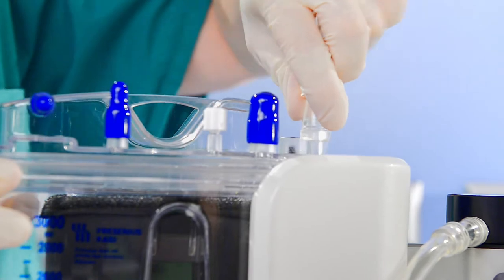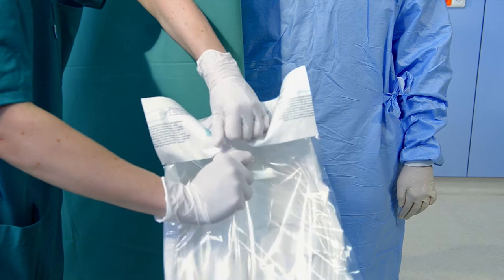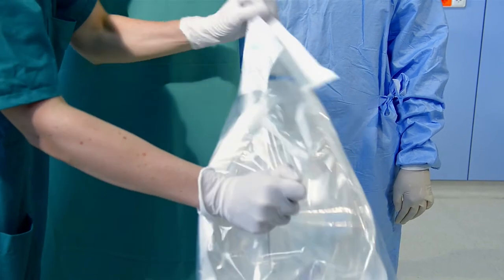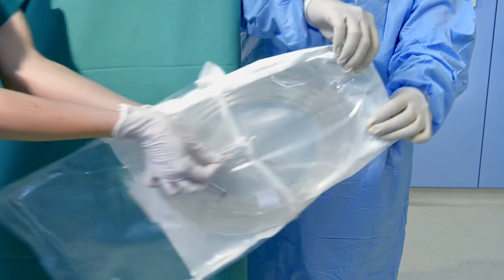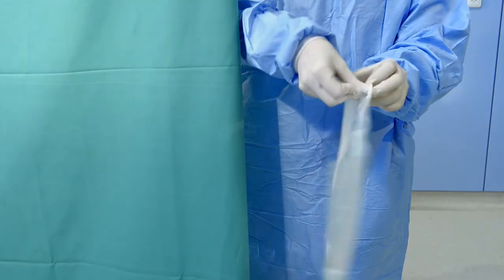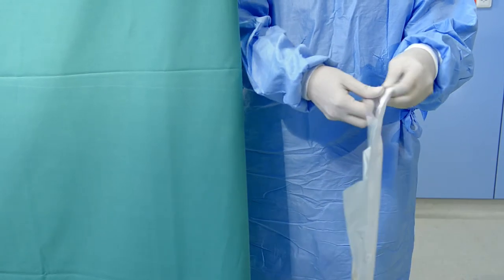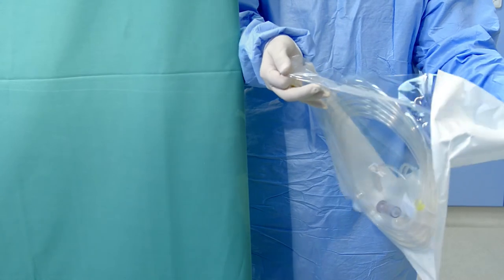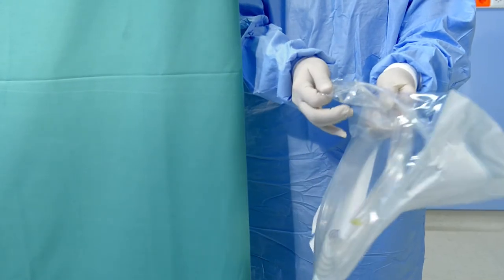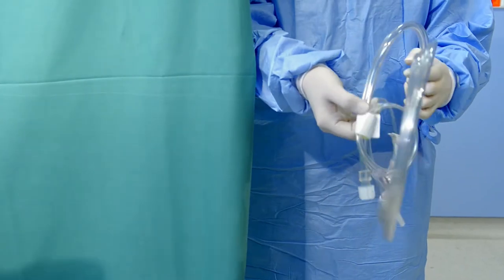The double lumen suction line must be unpacked and prepared at the sterile field. Open the outer packaging. The sterile nurse should take the inner sterile packaging without touching the outer blister pack. The ATS suction line can be unpacked and prepared with suction tip at the sterile field. The reservoir connection and drip chamber with spike should be handed out to the anesthesia team over the towel.